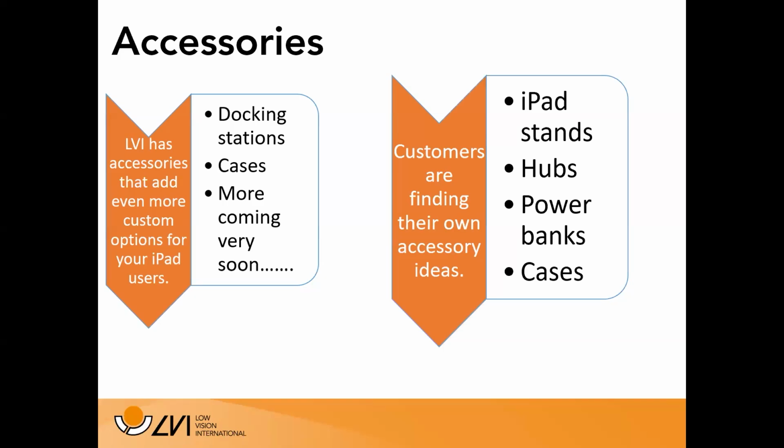We are actively looking into that, and will communicate solutions that we find that work well for that purpose. We know that some of our reseller network have had people, especially in education environments, request power banks or solutions so that their students can recharge their iPad throughout the day. So, for instance, if a student is using a Magnilink Mini and an iPad that's in a stand, and they finish their class, power down their iPad, and maybe they've got a power bank in their backpack, they use a USB-C to USB-C connection to quick charge their iPad back up in between classes.